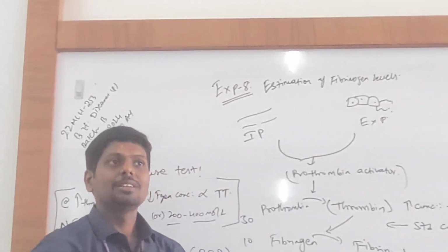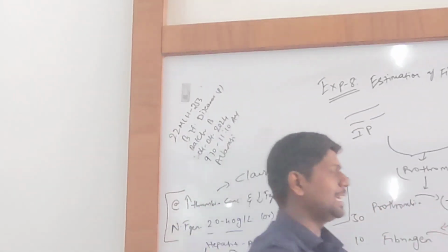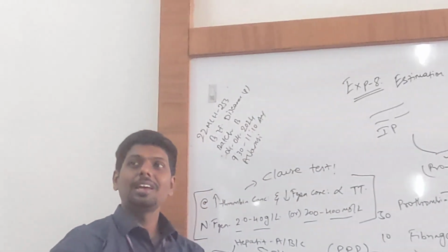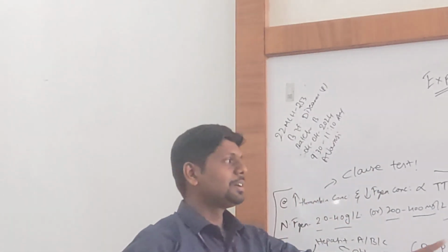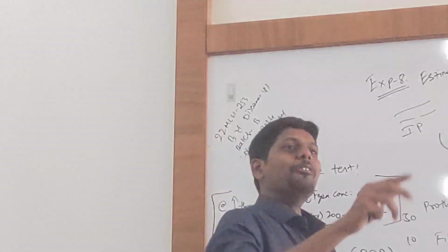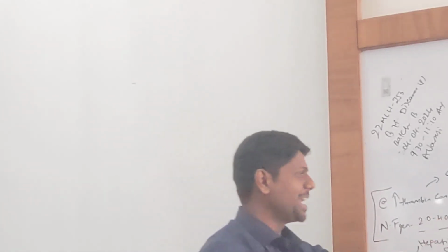Got it? You can ask critical questions later because it is creative. We'll see. Anyway, overall efficiency can be checked by TGT. So all values are equally important. Got my point? Has anyone understood what Muskan's issue is? Serial dilution should be done. We'll see later. Wait, let me finish my topic. We'll work on it later.